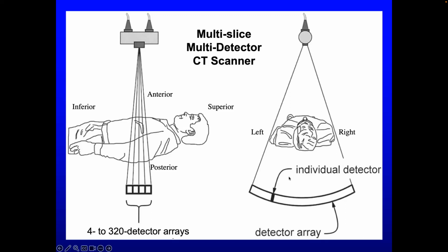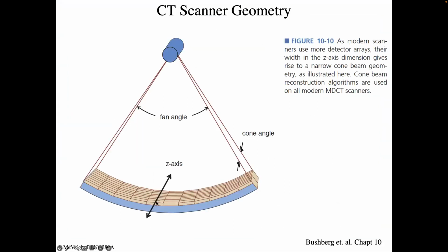And so nowadays, a modern detector, as you've seen in those examples, has about 1,000 elements this way and upwards of 256 this way. So it's like having 256 of those original fan beam scanners stacked on top of each other, right? So that's why you get an image of the heart in 150 milliseconds, because the whole heart projects onto this detector, right? So you can see the entire heart, and then when you rotate around, you get all the data you need.